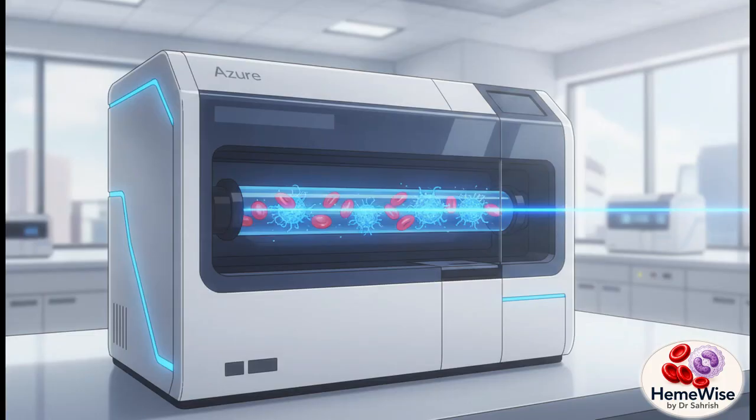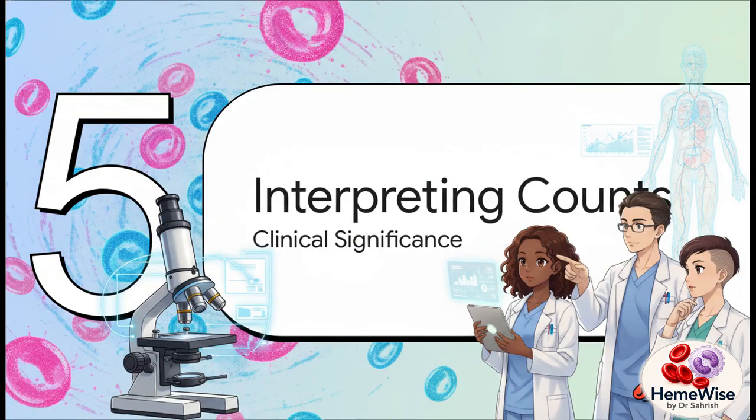Now, while the Miller disc is a total classic, modern automated reticulocyte counters represent a massive leap forward. By utilizing specific stains like Azure B in combination with flow cytometry, these analyzers dramatically improve our accuracy. They effectively screen out all those visual mimickers we talked about earlier, like the Heinz bodies and Howell-Jolly bodies. This significantly reduces the false positive results that can plague manual counting methods, giving us incredibly reliable data instantly. Let's wrap things up with Section 5, interpreting reticulocyte counts and their clinical significance.